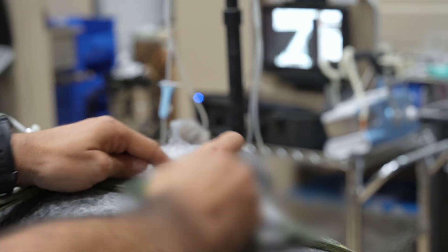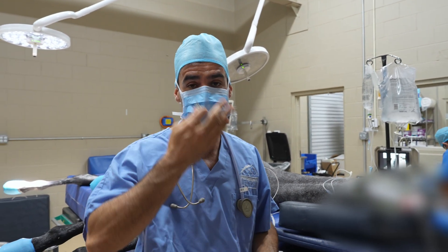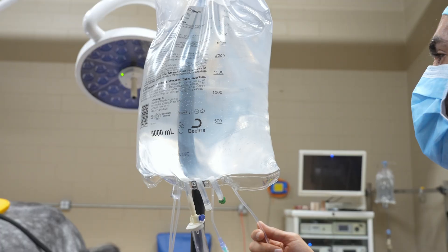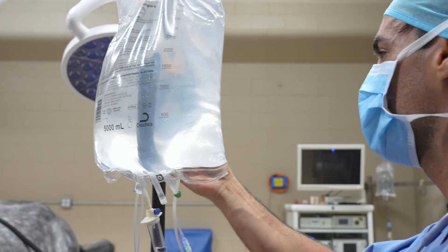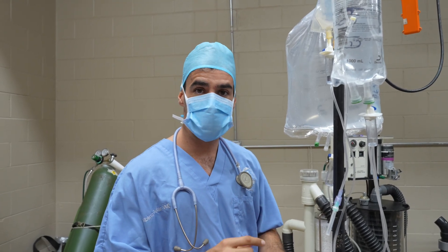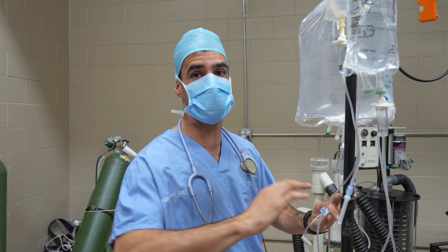Since the horse is going to be under anesthesia, he's not blinking. So we have to take care of the cornea to keep it from getting too dry — we put something on it to keep the moisture. Now I'm adjusting the dobutamine drip because his arterial pressure is a little bit low. I'm going to use some dobutamine to increase that and make sure he has good perfusion during surgery.